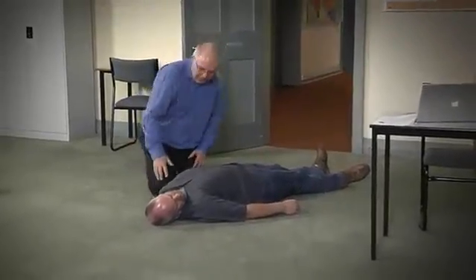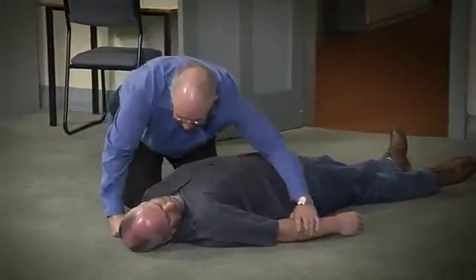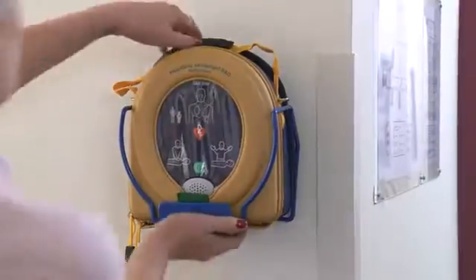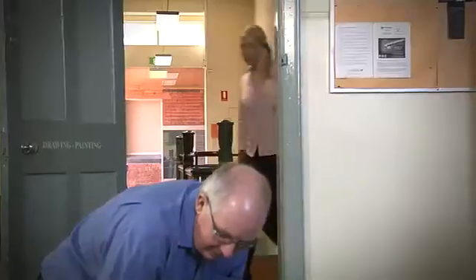If you find someone who appears to be unconscious, is not showing any signs of responsiveness, and is not breathing, remain calm. Call for help, retrieve the AED, and begin CPR.